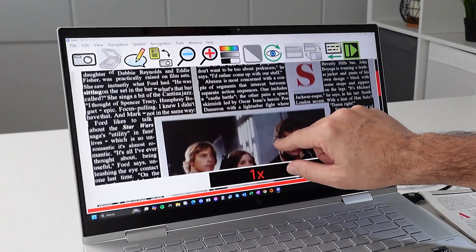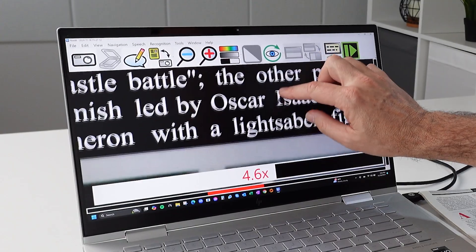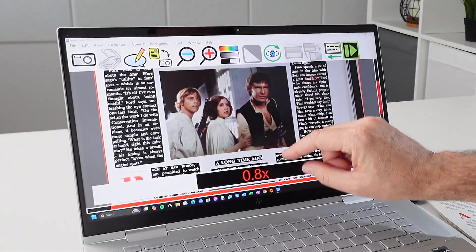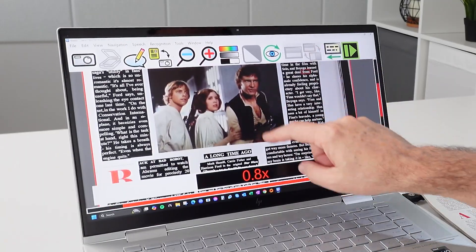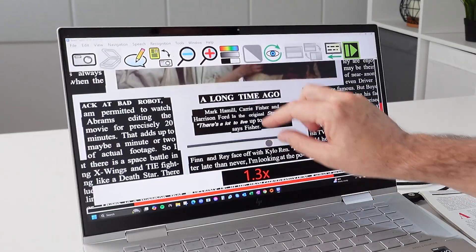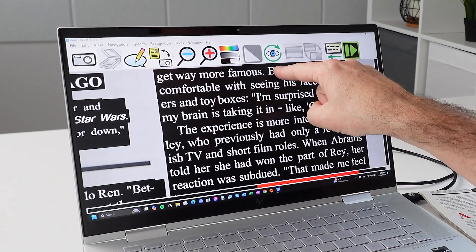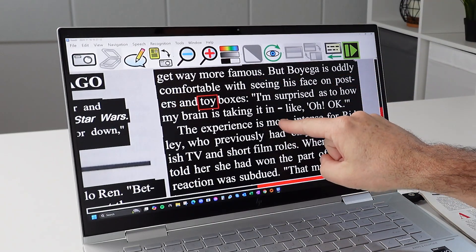Let me show you how that works. I have the computer text and I can zoom in to where I can actually read it, but I still get my pictures in there. Check out Han Solo, Leia, and Luke having a good time. I can look at the photos and read all at the same time without making any other changes. If I want to read somewhere, just touch — 'Boyega is oddly comfortable with seeing his face on posters and toy boxes.' Very cool.